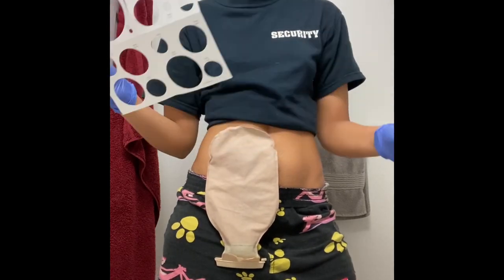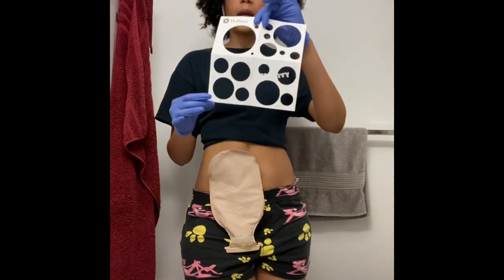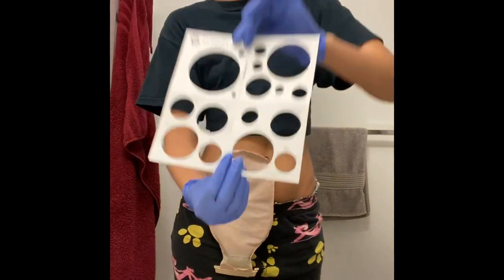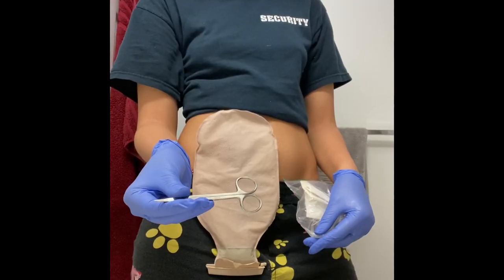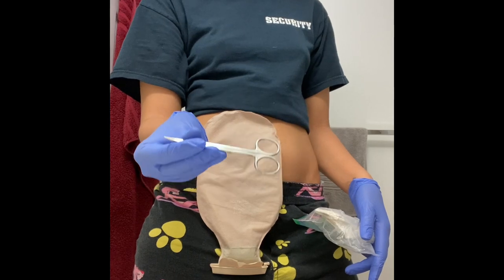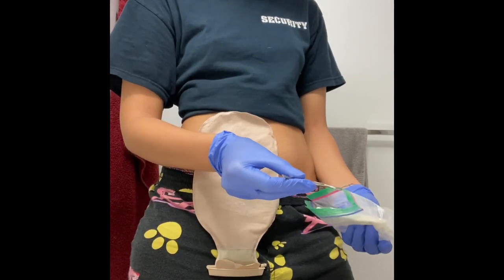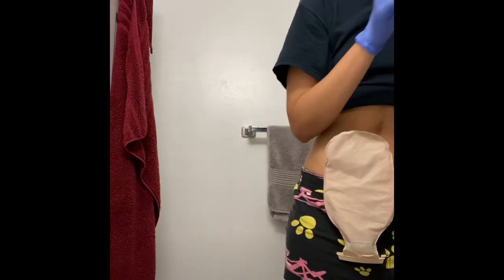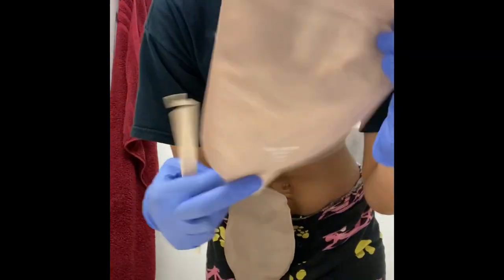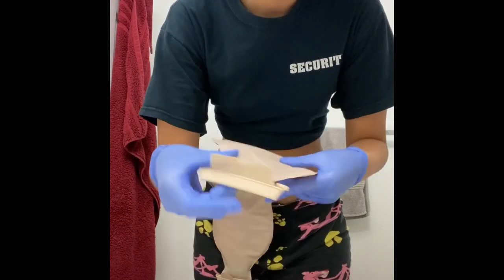We are going to be measuring my stoma once I get the bag off. I like to use this chart to ensure I'm using the right size bag and flange to protect my ostomy. Here I have a pair of ostomy scissors I use to cut flanges, as well as my paper towel squares. Here I have my ostomy support belt — I won't be using it this time but I generally do. I now have the clamp closure I'm going to place on the end of my bag just to keep all the stool in.